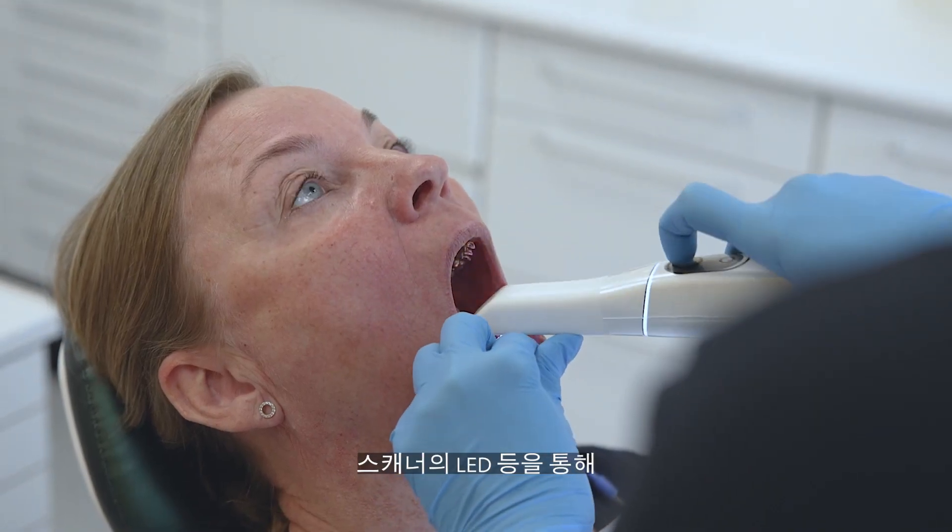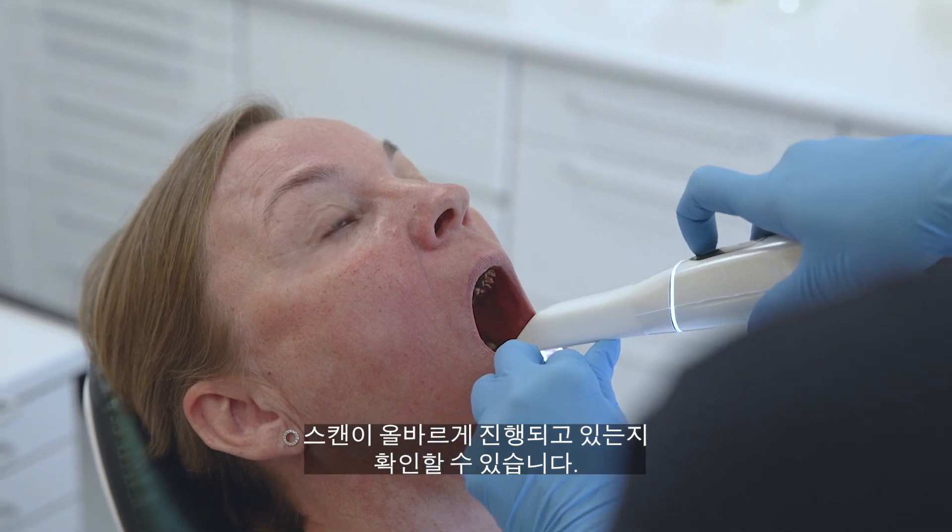You can see with the LED light on the scanner whether you are on the right track or not. So you don't have to keep so much focus on the screen.